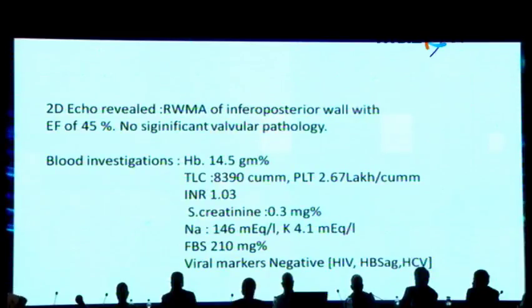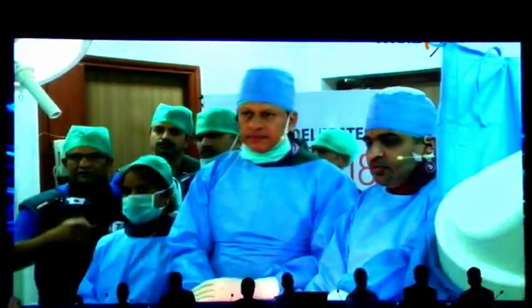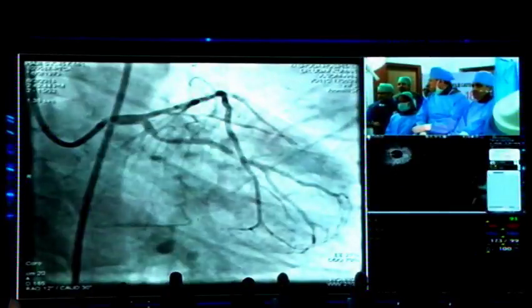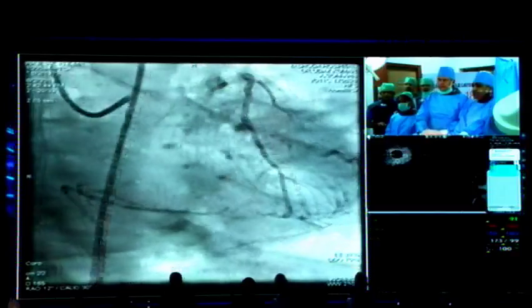Okay, can we have the angio, please? Can we put the angio on the screen, please? Play the angio, please. Can you play the angio? Yes, can you see the angio?